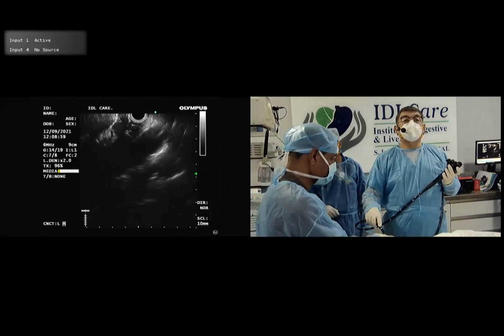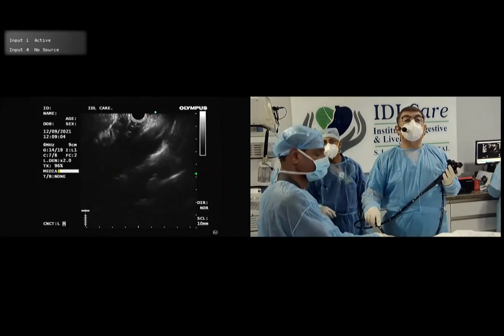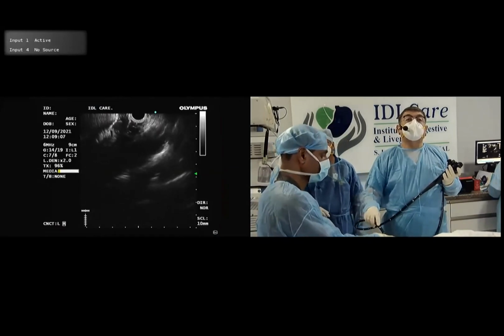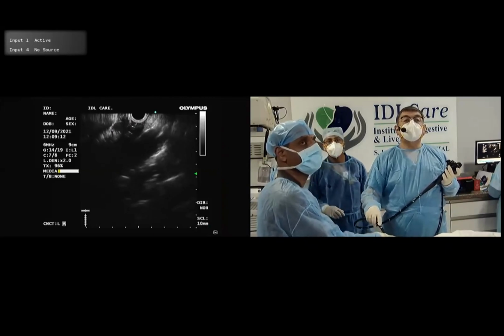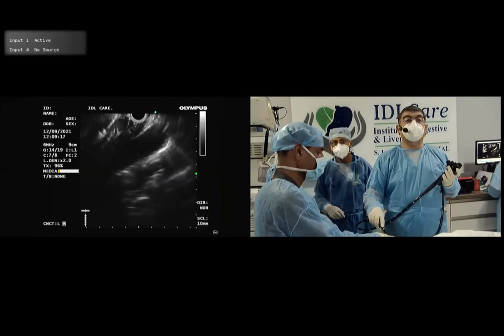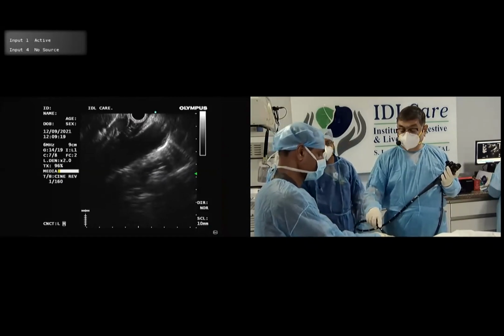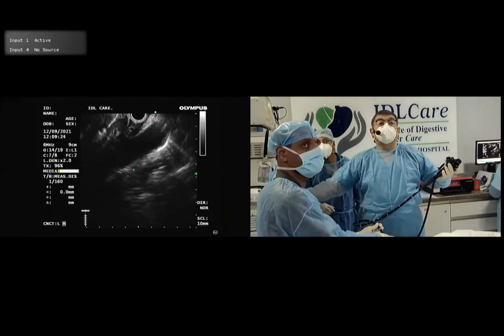So when a patient has come with an abdominal pathology and does not have any obvious mediastinal pathology, I like to just trace the esophagus in a sagittal manner. So you see here, freeze. I have rotated my scope in such a way that you are seeing both the walls of the esophagus. You see, this is the muscularis propria on one side. This is the muscularis propria on the other side. And this is the lumen of the esophagus.